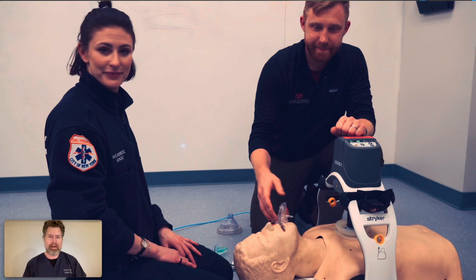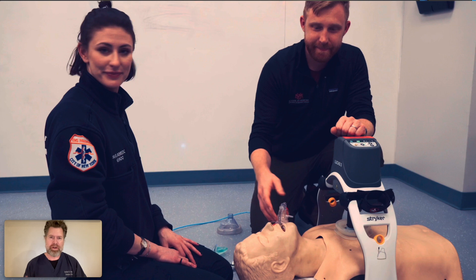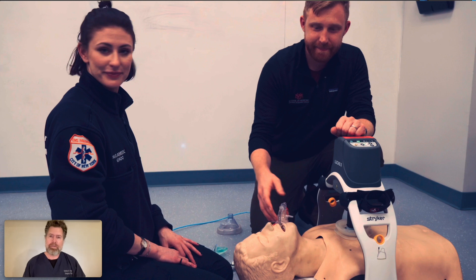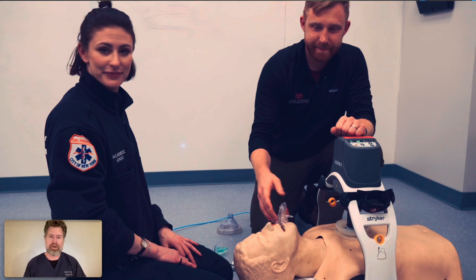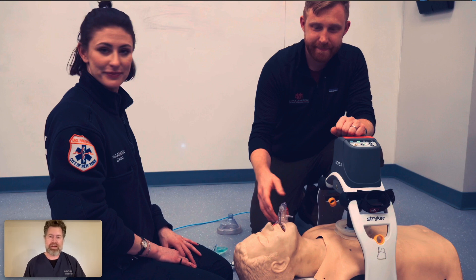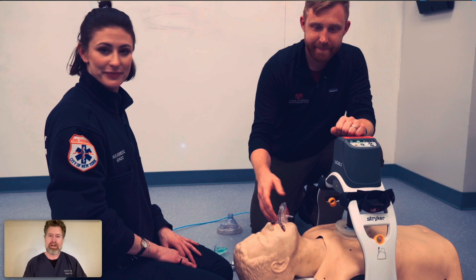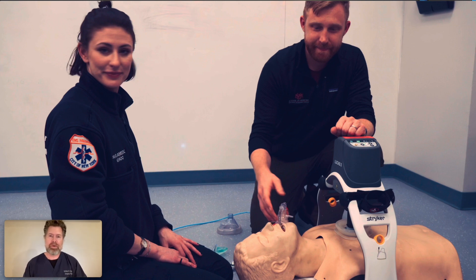Rather than saying 'can you stop for just one second? I've almost got it' — and that two or three or four seconds turns into 30 or 40 seconds to get the tube in place — you can see that intubating the patient with the Lucas device ongoing was relatively easy. Probably one of the most important devices in this video is the mechanical CPR device, because it actually improves airway management, time to endotracheal tube placement, and chest compression fraction.